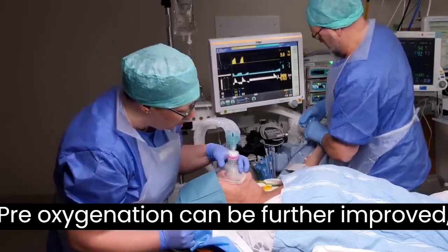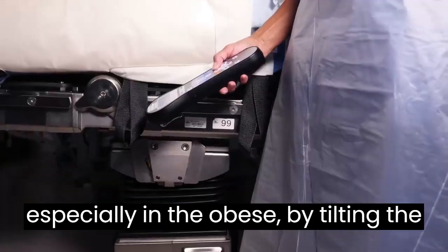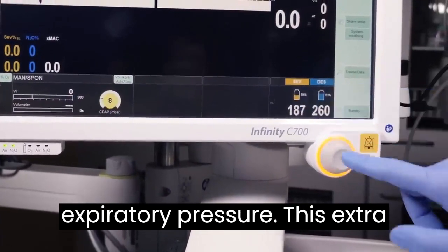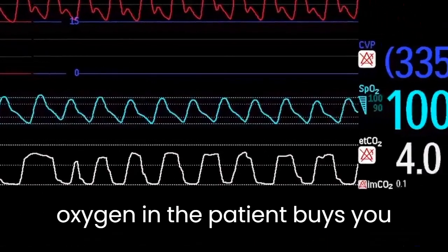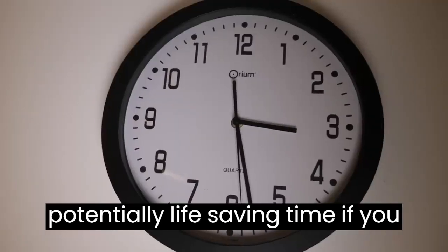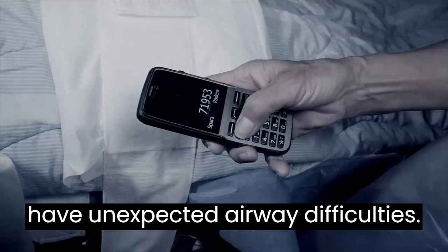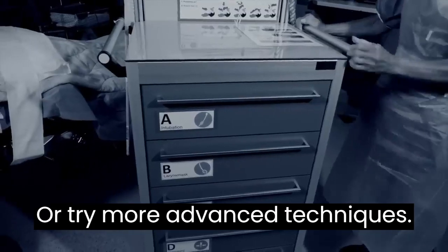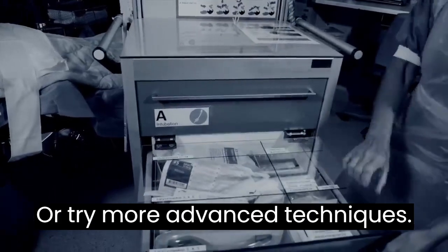Pre-oxygenation can be further improved, especially in the obese, by tilting the table and by applying a positive end expiratory pressure. This extra oxygen in the patient buys you potentially life-saving time if you have unexpected airway difficulties, precious time to call for help or try more advanced techniques.